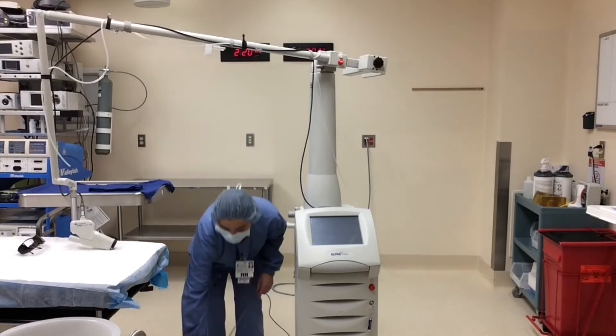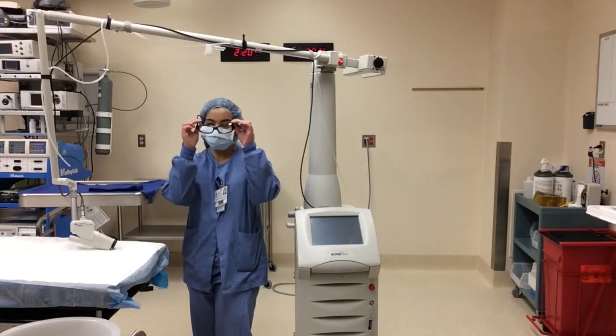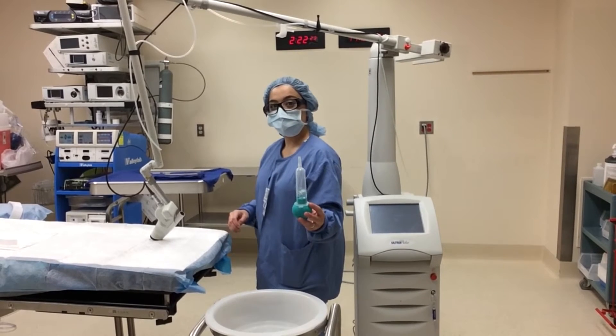As you can see, the pedal has a cover so it cannot be accidentally stepped on. Safety first! Everyone in the room must wear the appropriate goggles during the testing. Fluid should also be available.